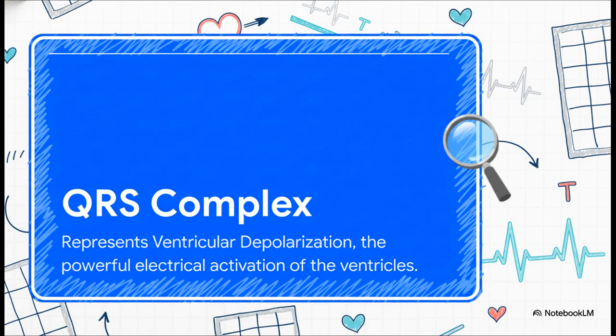And here's the headliner, the QRS complex. You can't miss it. It's that big, spiky part of the waveform. And it's so big for a reason. It represents the powerful activation of the ventricles, those lower chambers that have to do the heavy lifting of pumping blood to your entire body. So yeah, it's a big deal.